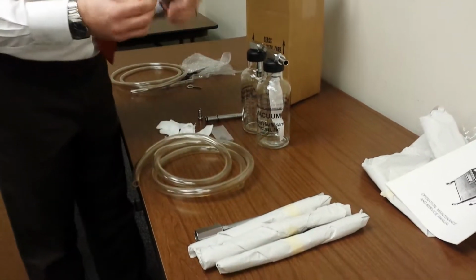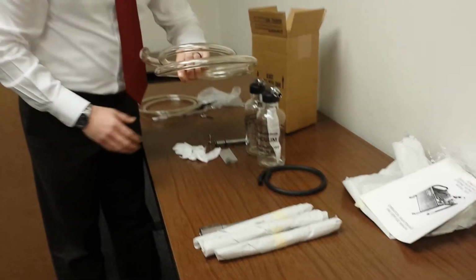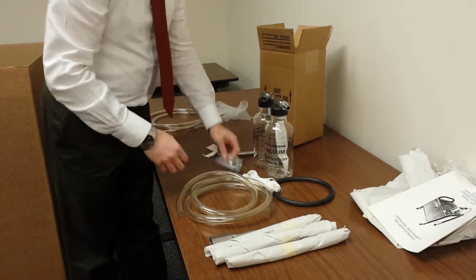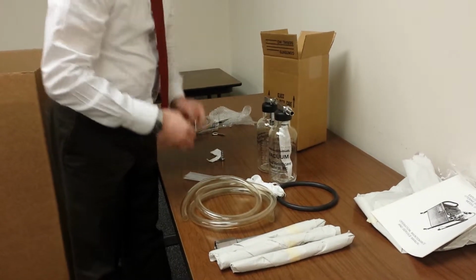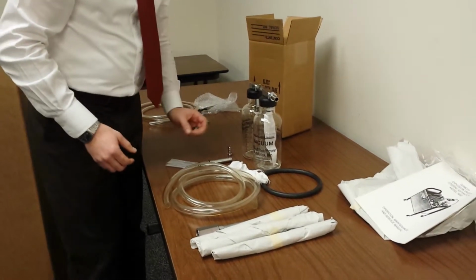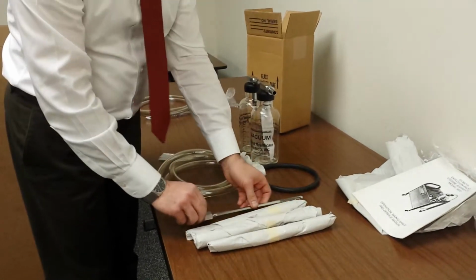You'll have a black aspirator tubing. You'll have some 1/2-inch clear aspirator tubing. You'll have replacement specimen collection socks. You'll have a reusable curette adapter. You'll have a 3/8-inch tubing adapter, which will come into play in a minute here. And then you'll have 4 reusable curettes.